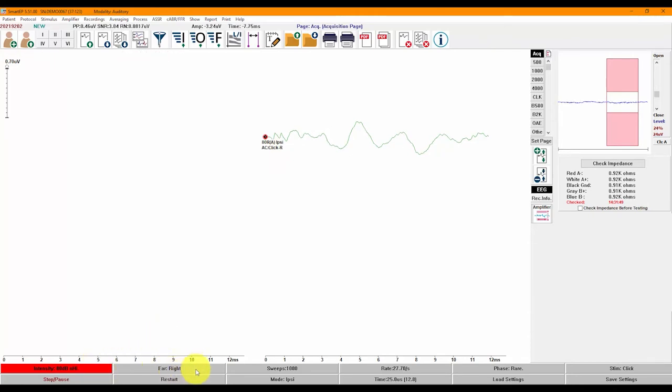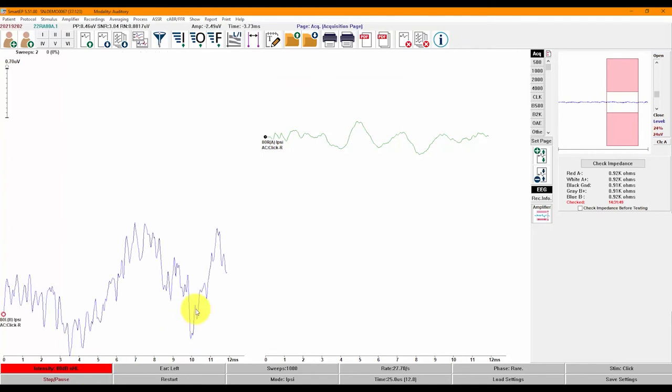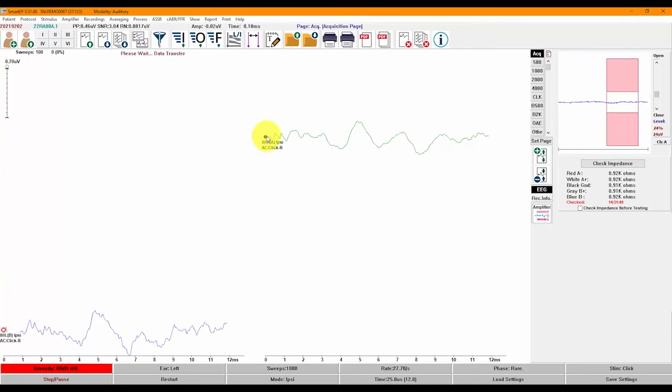To mark the peaks, first make sure the waveform you're trying to label is selected — selected waveforms are green in color. Click on the label for the peak you're trying to mark, then click right above or below the waveform where you would like to place it. Once the peak label is placed, you will notice there are two triangles — one at the top facing down (the latency marker) and one at the bottom facing up (the amplitude marker). You can adjust the position of either marker by clicking and dragging or using the keyboard: use the right and left arrow keys for the latency marker, and the right or left arrow keys while holding Alt for the amplitude marker.